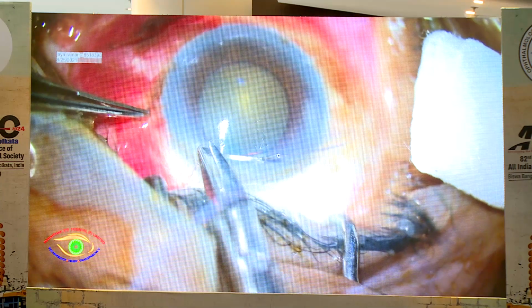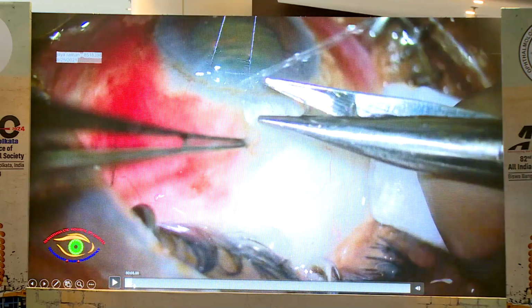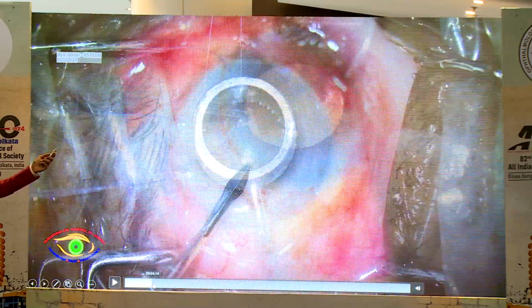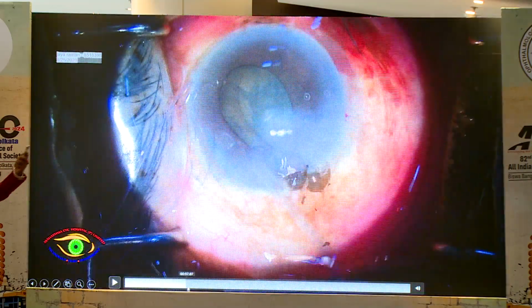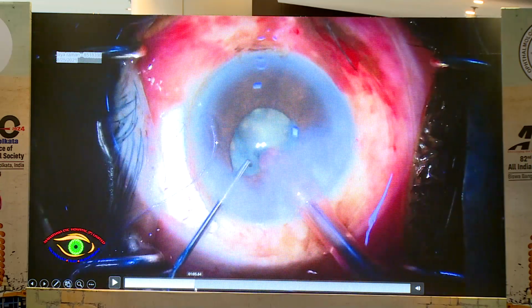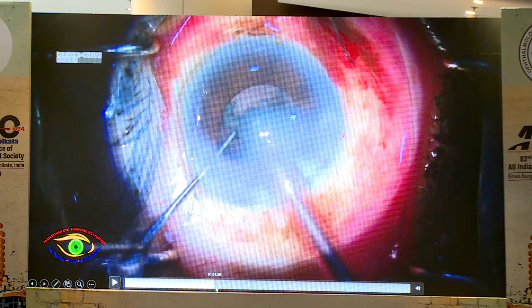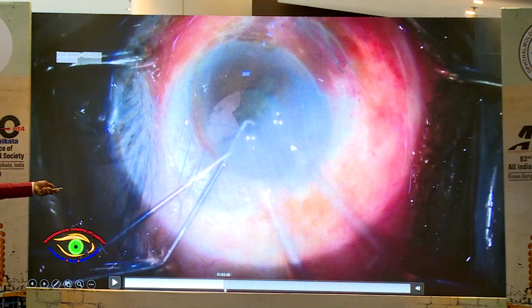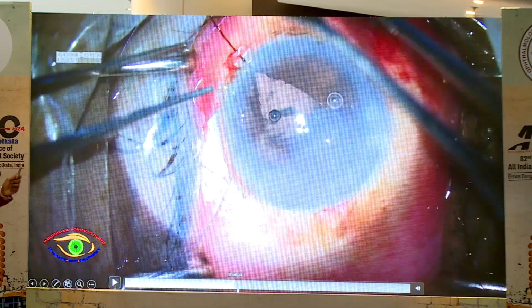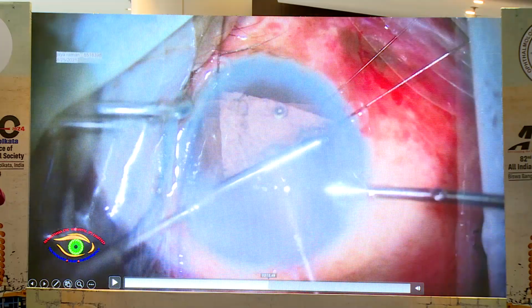Again, this is a very important real-time scenario which I wanted to share. This is one of my cases of combined surgery. I started the surgery, things were all going as per plan, but then the surgery got complicated. You can see that there was an iris prolapse, corneal edema, one of my earlier cases, where there was a PC rent, which I managed very effectively. You can see that the rent has happened, but then the cornea also was very cloudy, but that's not the point here. The surgery was managed, the anterior vitrectomy was done, and all's well that ends well.